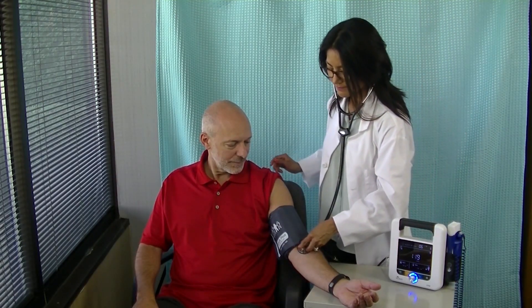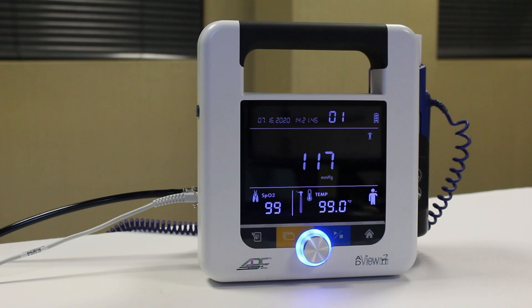The display will show the current cuff pressure, similar to an analog sphyg gauge. While the cuff is inflating, position the stethoscope over the brachial artery distal to the antecubital fold, as shown. When the cuff reaches maximum pressure, deflation will begin automatically and you can begin auscultation. When the measurement has been determined, press the start-stop button again to fully deflate any pressure remaining in the cuff.